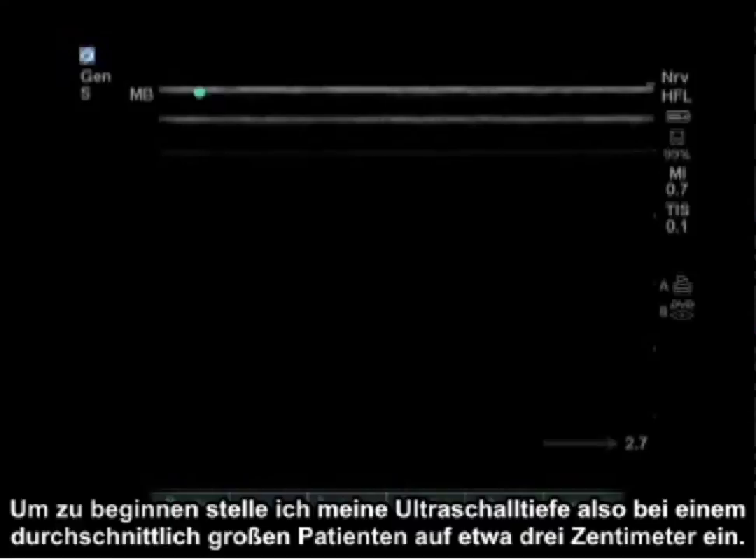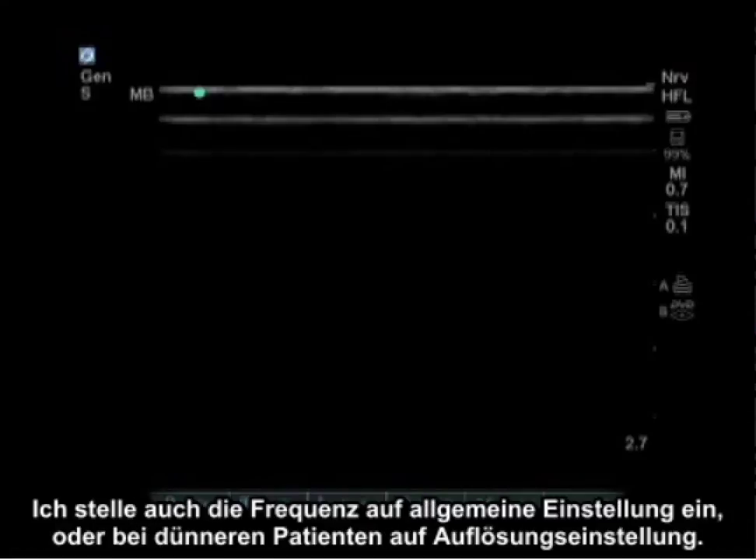To start, I usually set my ultrasound depth to approximately three centimeters in an average size patient. I also set the frequency to the general setting or resolution setting in skinnier patients.